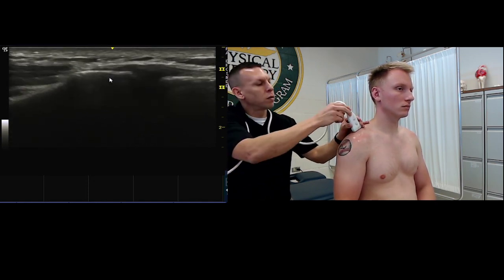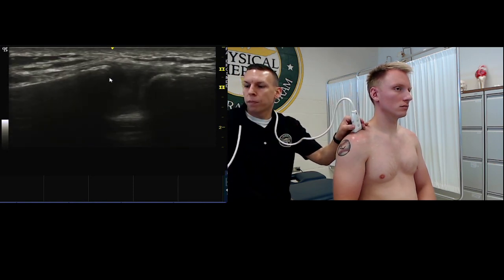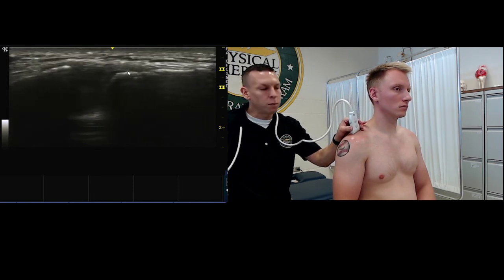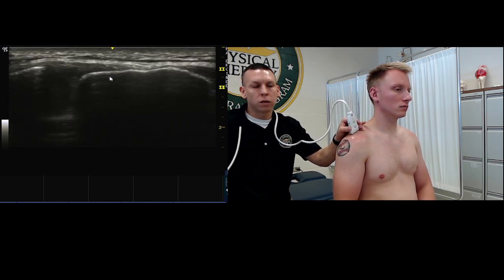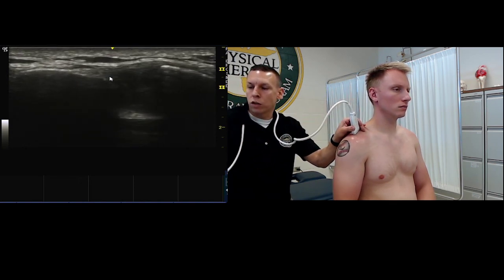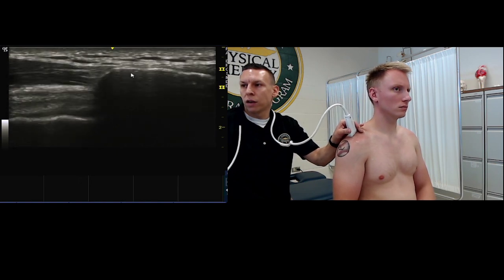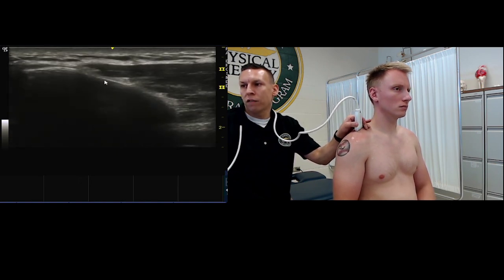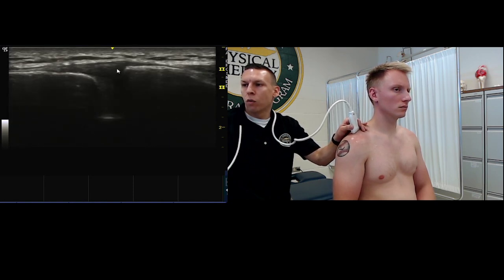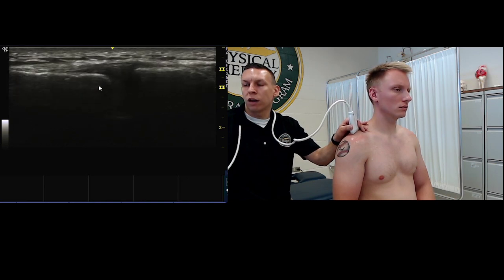I'm kind of backwards from the way I started. Let's keep it this way. So to the left here is the clavicle. I've moved my probe backwards from where I started. I'm going to move it back so the indicator's towards the right shoulder. And so now to the right here is the acromion, and to the left here is the clavicle. Not to add confusion here, but identify one of those two bones so you can identify the joint.